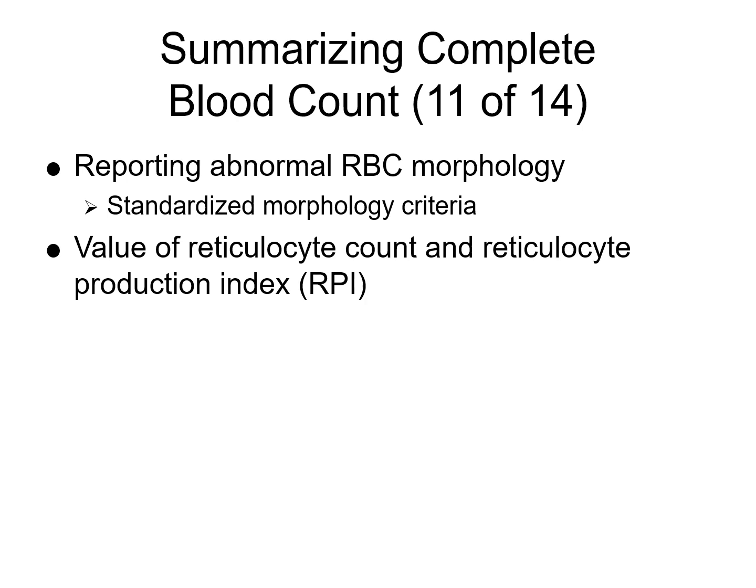We're going to quantify abnormalities when possible as mild, moderate, or marked, and each lab has its own criteria for whether something is mild, moderate, or marked, so make sure you know what you're looking at there.